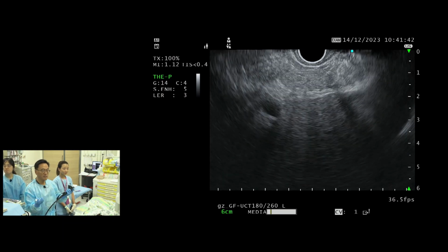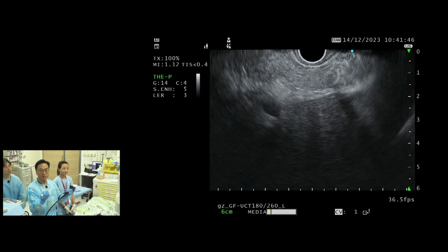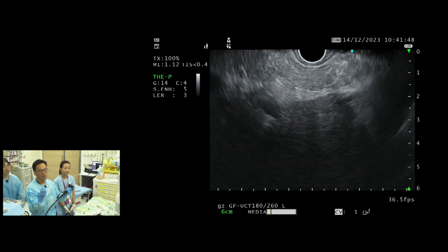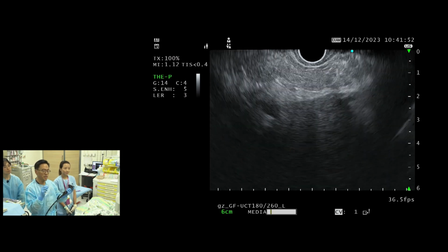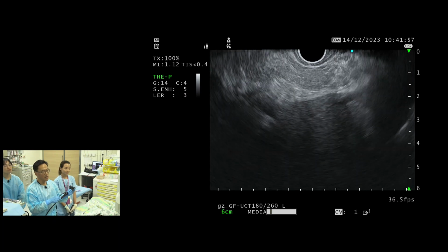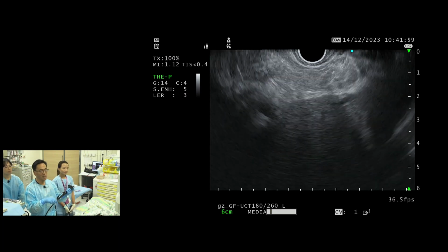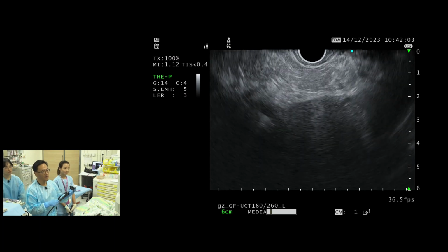On the hepatic vein side, essentially we want to be able to measure the IVC pressure. So we could target the IVC, but that's a little bit more risky because typically you're not putting your needle through liver, and the device is not on label for IVC. It is on label for the hepatic vein.